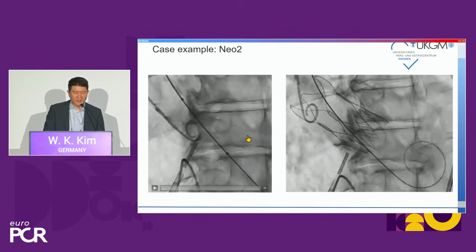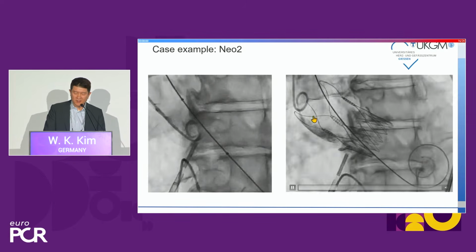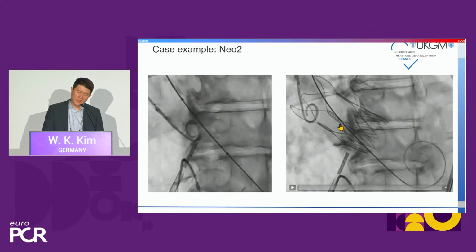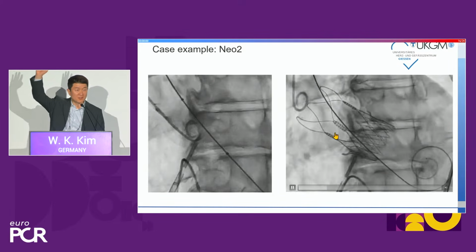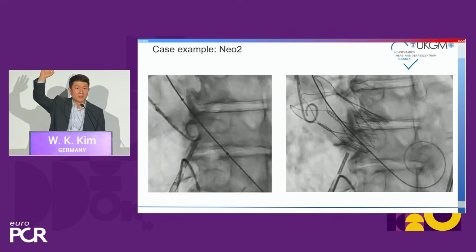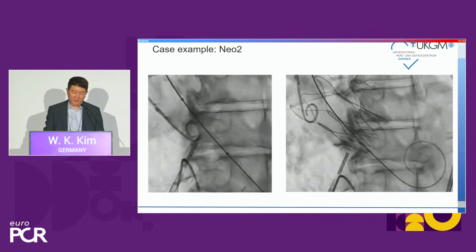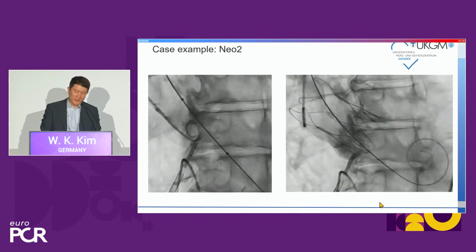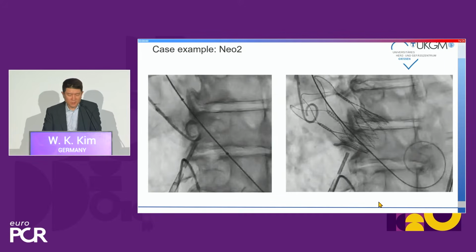problem. So this was a case that I proctored, and you can see that after initial deployment, there was still some residual leak. You may appreciate, who can see that the stent posts are not parallelly aligned? Who sees it? Okay. And who thinks it's parallel? Just please, or you don't know. Okay, it's difficult. It took me a while until I really understood what to be looking at.